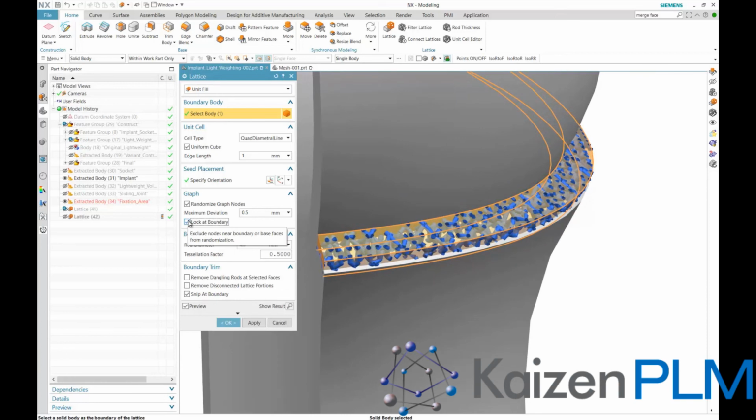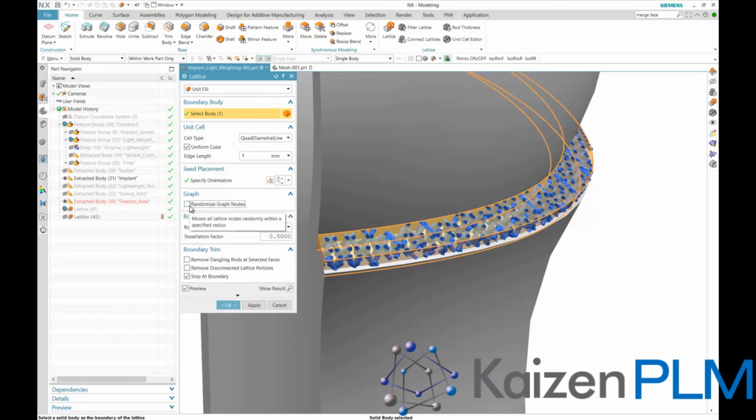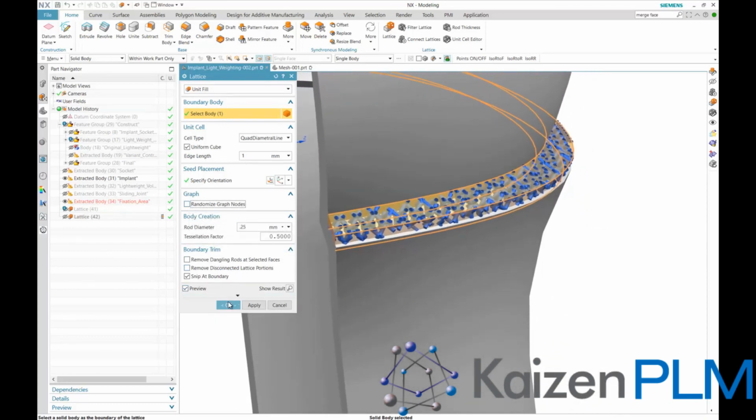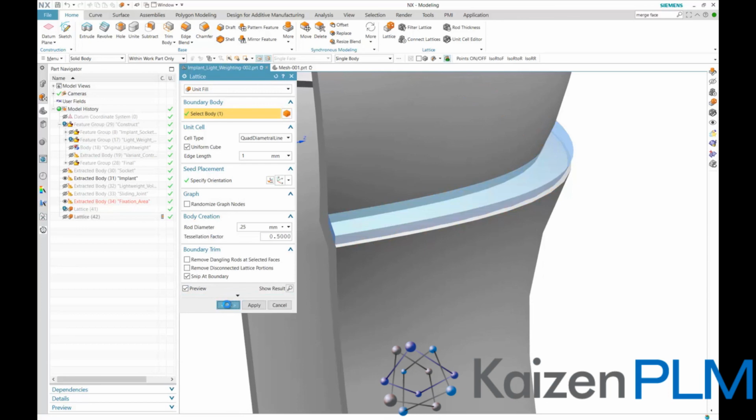Inside, the randomization will be executed as per requested if the volume is big enough. In this example, the volume is very small and the randomization is very limited with this option. As the regular pattern in our example is better fit for our solution, we turn the randomization off and accept the result.